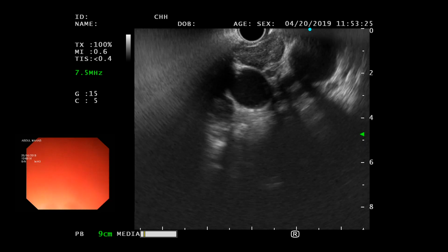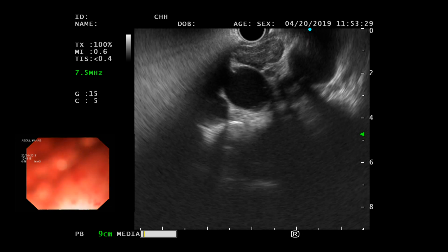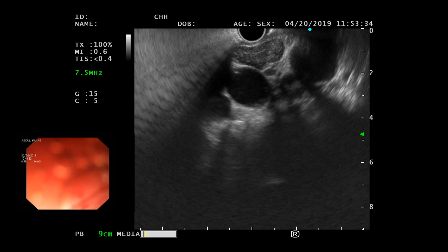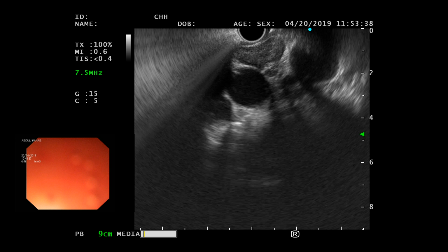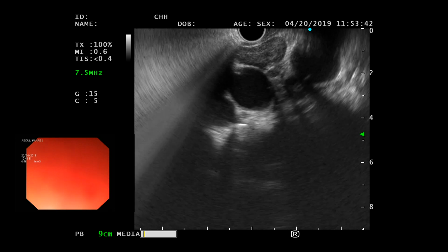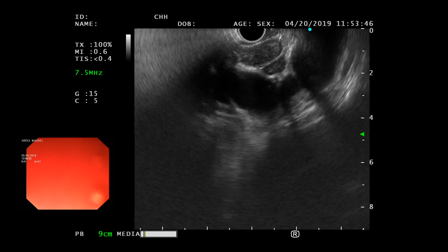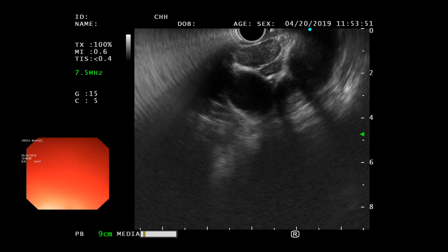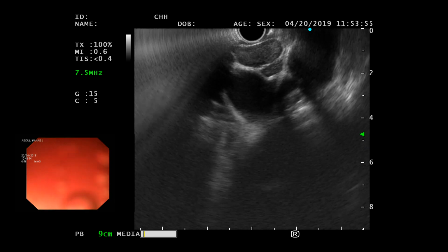I want some saline as well, and GeneXpert for TB, okay. You can go back to the next room if there's something interesting going on there. But to be honest, I really can't remember when I last saw such big lymph nodes in AP window, because we don't deal with this. This lymph node is very pathological looking.